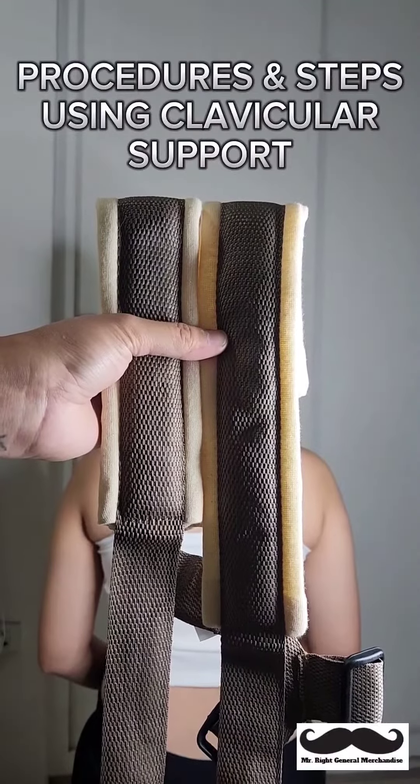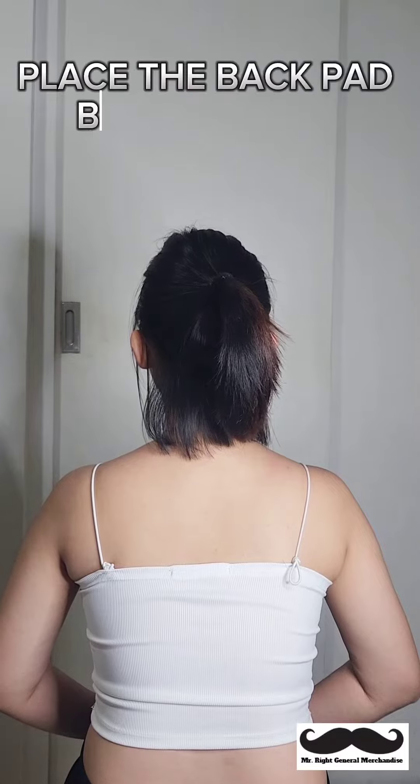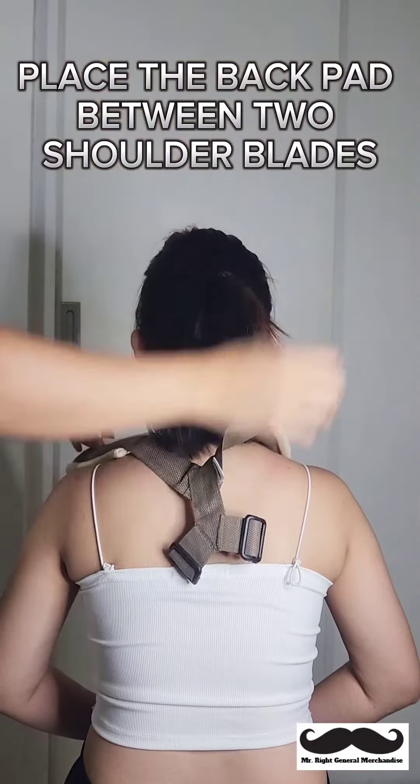Procedures and steps in clavicular support. Place the back pad between two shoulder blades.